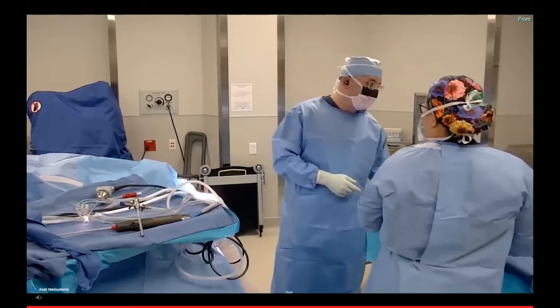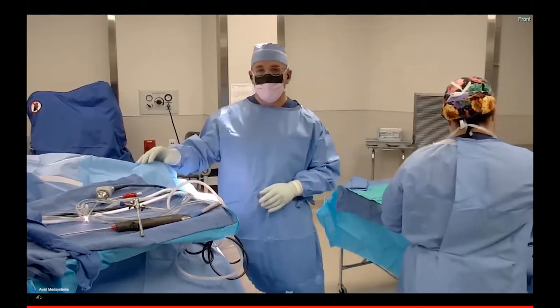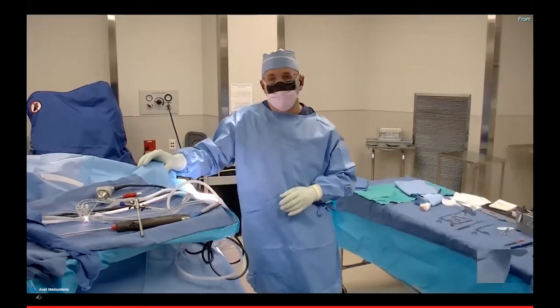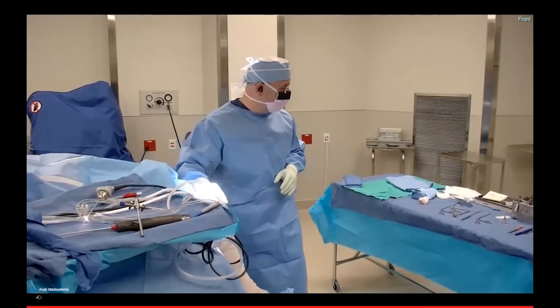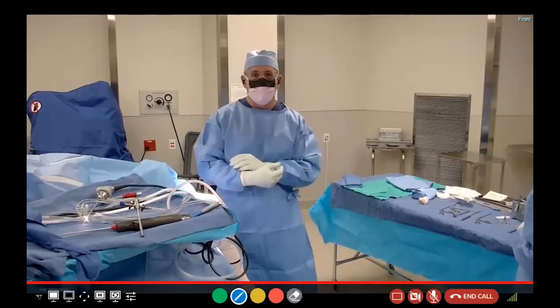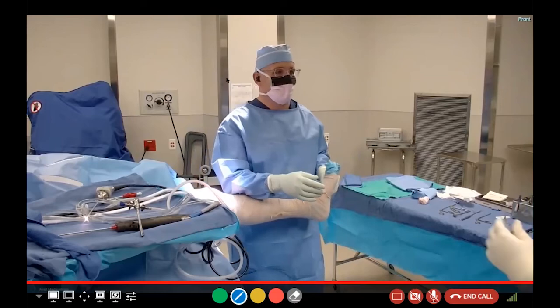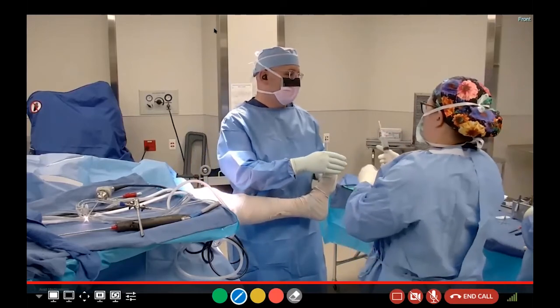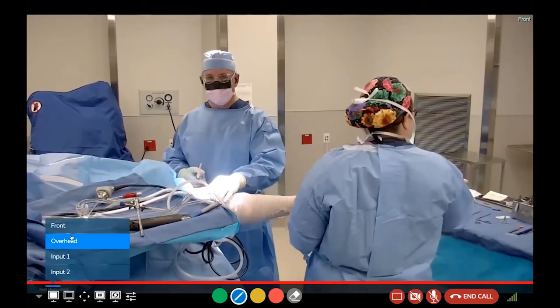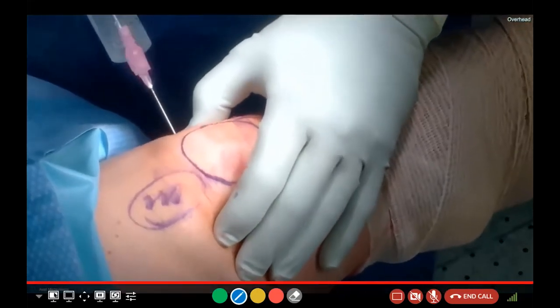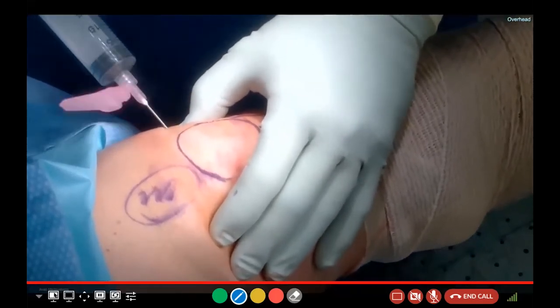I'm going to inject the knee. This is a debate for us in orthopedics. We put a little numbing medicine in there so they don't hurt so bad. I'm going to put a little steroid in there too — he does have some arthritis and I think that'll help. This is just injecting the knee right underneath the kneecap.